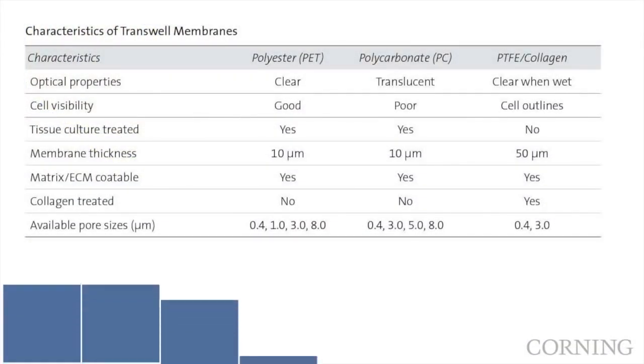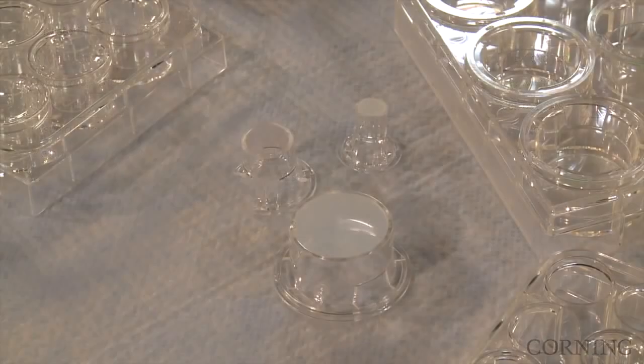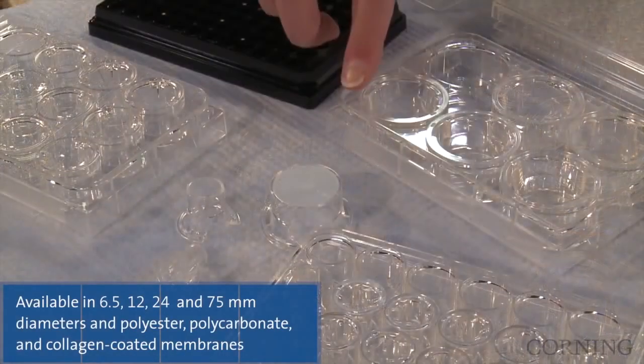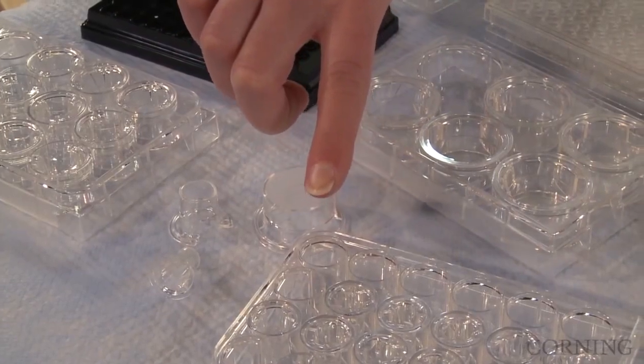Transwell inserts are available in polyester, polycarbonate, and collagen-coated PTFE membranes in a range of diameters and pore sizes to satisfy a variety of research requirements. Individual inserts are available in 6.5, 12, 24, and 75 mm sizes and come prepackaged in or with their corresponding multiple well plates.